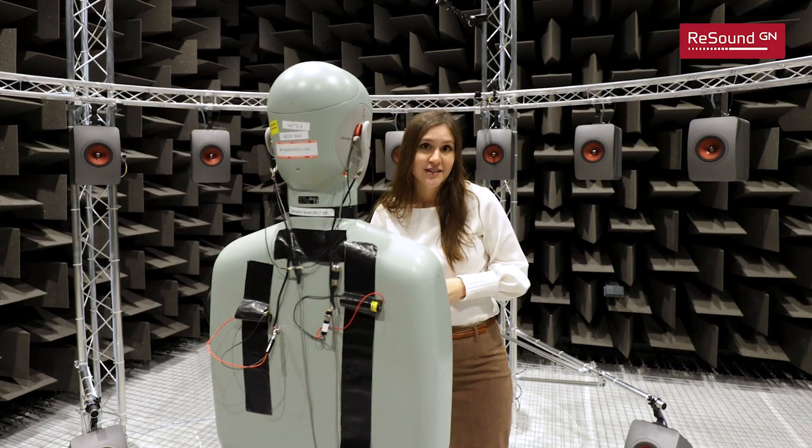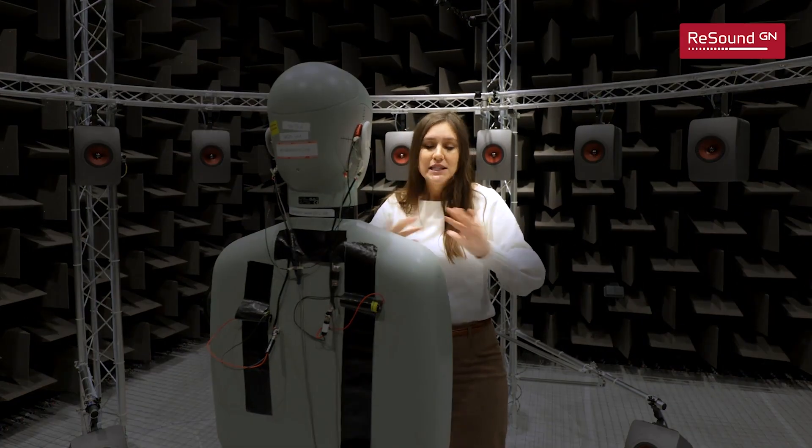The way most modern hearing aids manage speech clarity versus background noise is through hundreds of thousands or even millions of sub-variants - little moves they can make based on what they're hearing. Think of it as a pre-baked algorithm: when I hear a loud noise, this is how I respond; when I hear a voice, this is how I respond; when I hear a reverberation, I assume I'm in a large room and make adjustments. All of this works really well for some folks, but many still complain that in loud background noise environments it's hard to get clear speech from the person you actually want to hear.